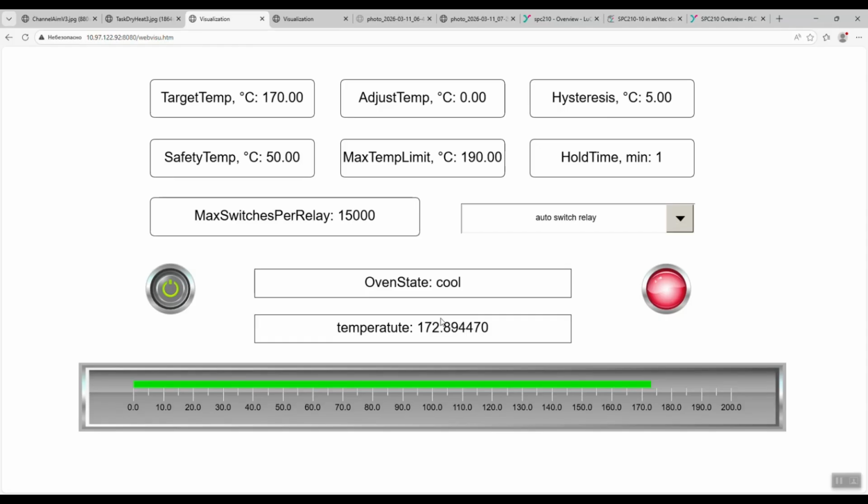After the holding time has elapsed, the sterilizer will switch to the air cooling phase. At the same time, once a temperature safe for humans is reached, the emergency lamp will turn off, indicating that it is now safe to remove the metal instruments. At that moment, the button indicator will also turn off.